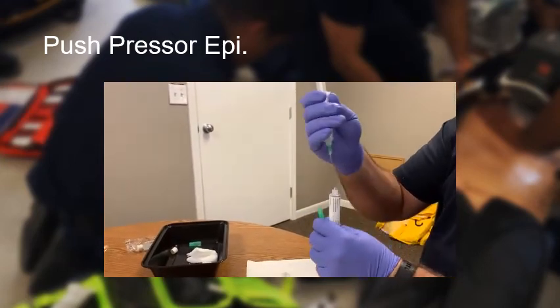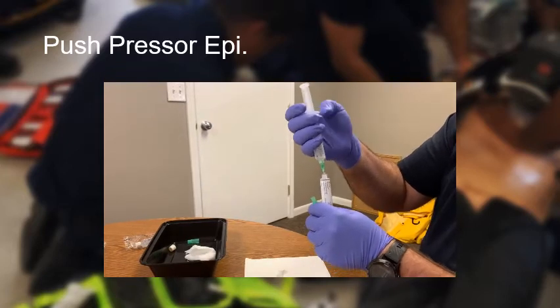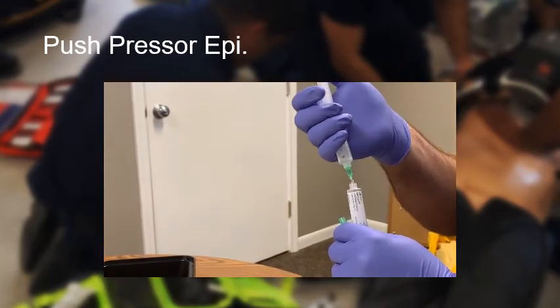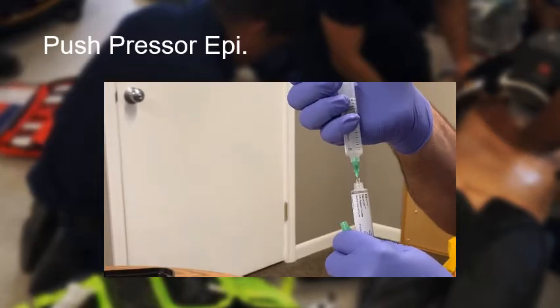Take your epinephrine 1 milligram per 10 ml and add 1 ml of the medication to the syringe. Mix slightly, and you have now created Push Pressor Epinephrine, concentration of 1 to 100,000 or 10 micrograms per ml.